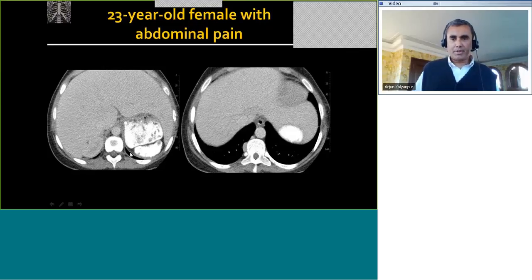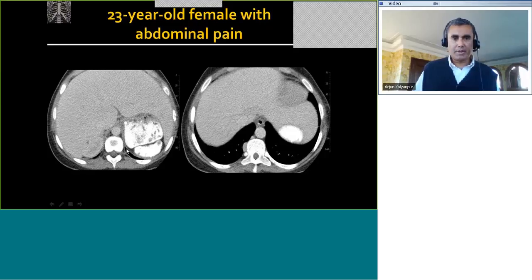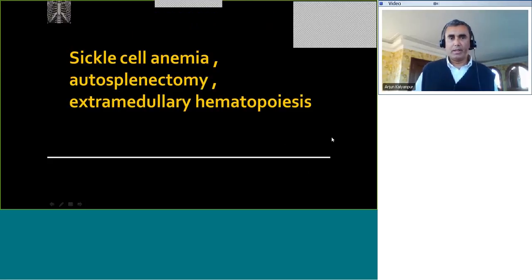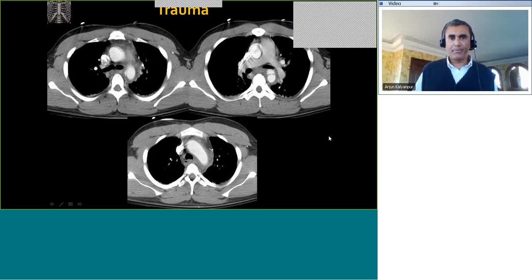The third finding, which is actually very hard to make on this scan because it is done in a soft tissue window, is the density of the bones. The vertebra and ribs are sclerotic. These bony changes are classical for sickle cell anemia.